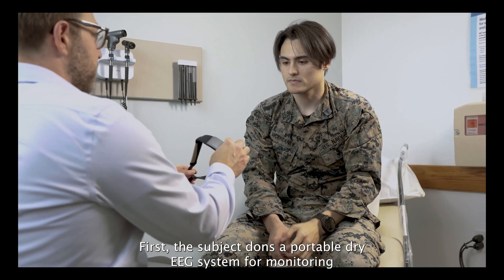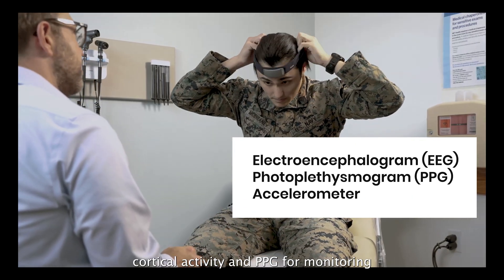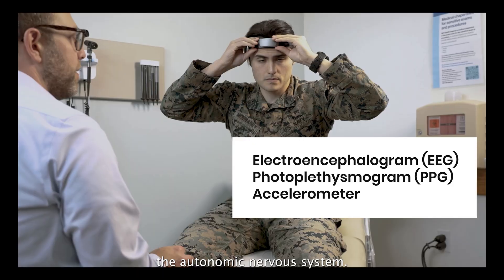First, the subject dons a portable dry EEG system for monitoring cortical activity and PPG for monitoring the autonomic nervous system.